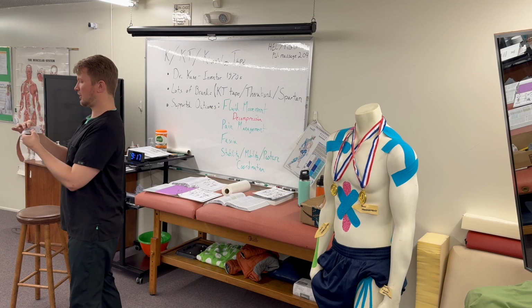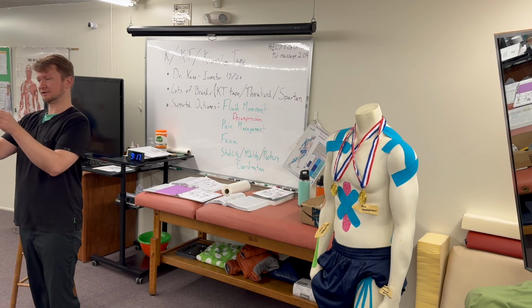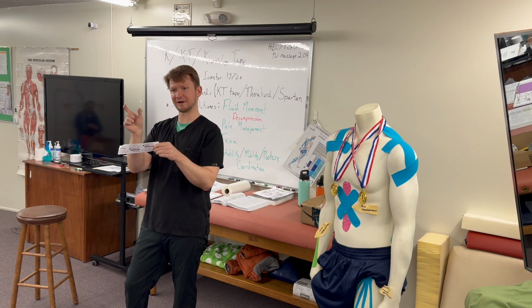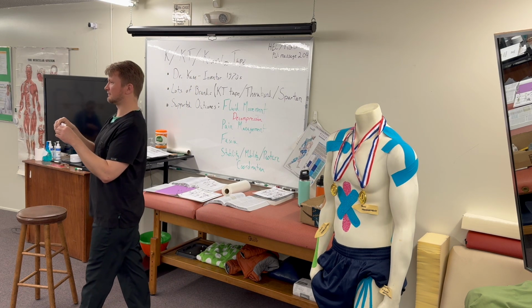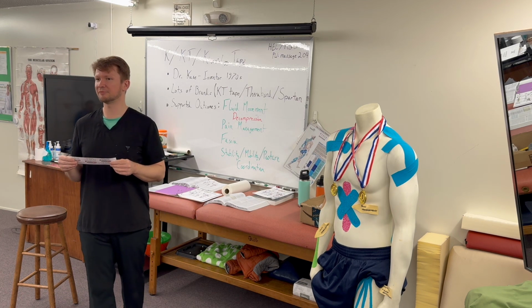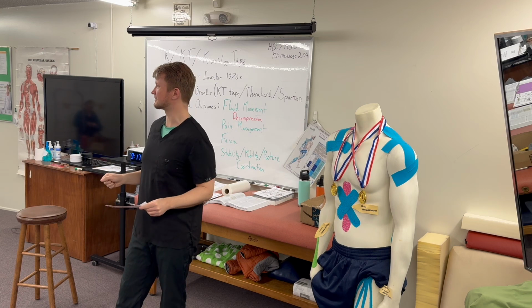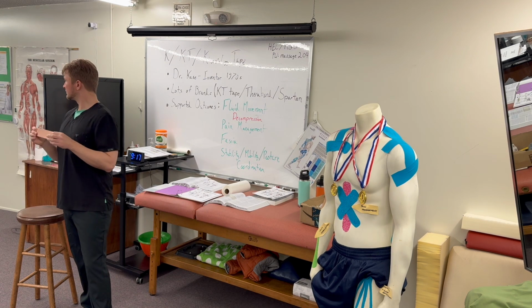And the small hexagon, when the tape is stretched, and it shows you on the back, when the tape is stretched to the point that that hexagon looks uniform, that means that you've stretched the tape at a 25% amount of tension. If you make the big hexagon uniform, then you're at 50%. So it's a nice objective marker in terms of just trying to figure out how much stretch you're applying. Because typically, you can be really guessing as you're stretching this and then putting it on the skin and making it have a shape and all of that. So this is really good for learning.